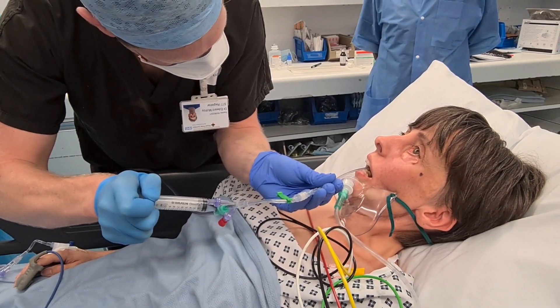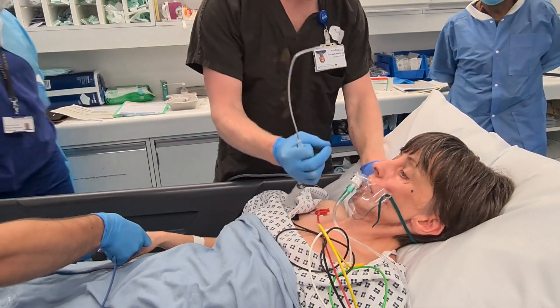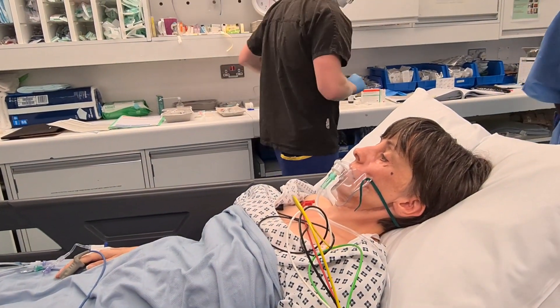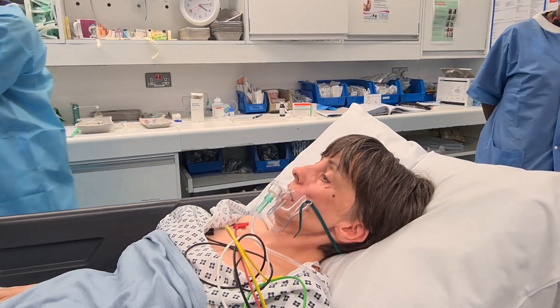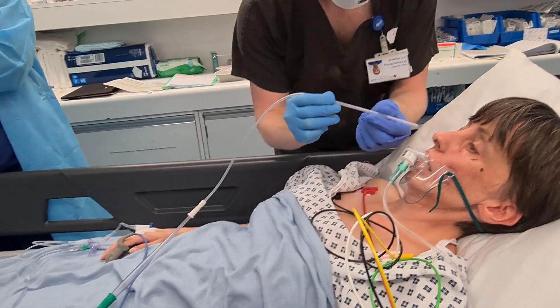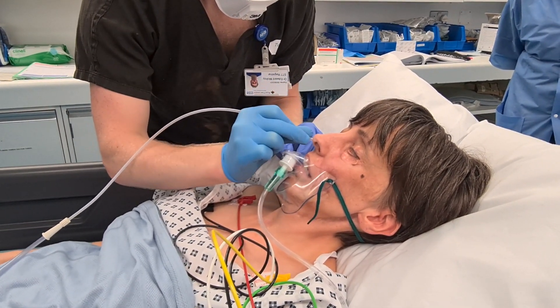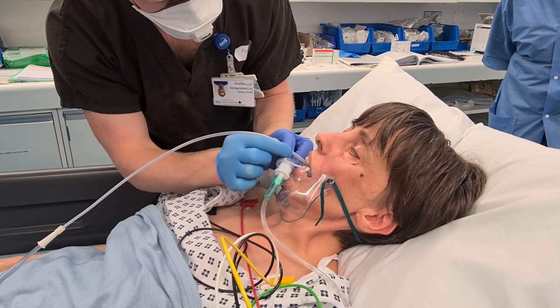Just going to give that a bit of time to work. Just so we can check that the nose is nice and numb — just going to use this suction catheter. This is just a little thin suction catheter. Is that really okay? It's not painful? Opening your mouth again. Is that going to go at the back there? Nice and numb? Good.